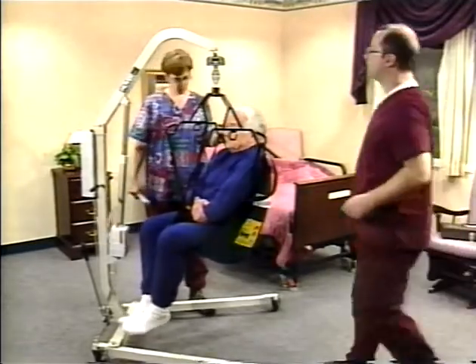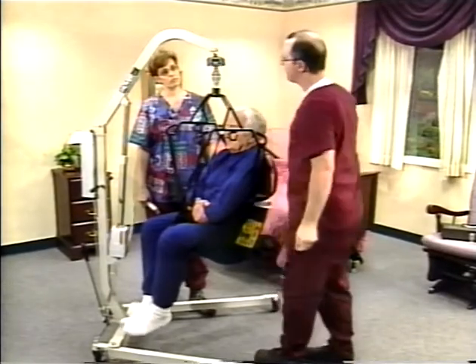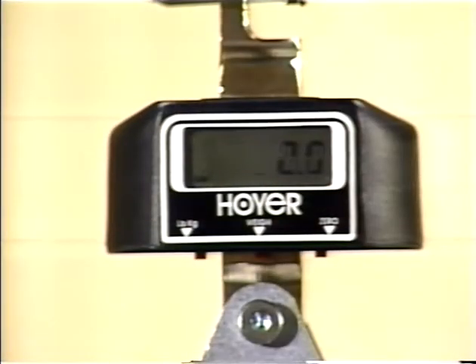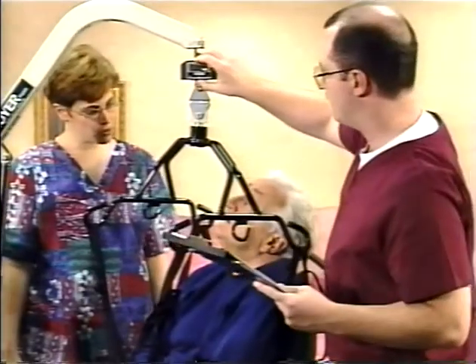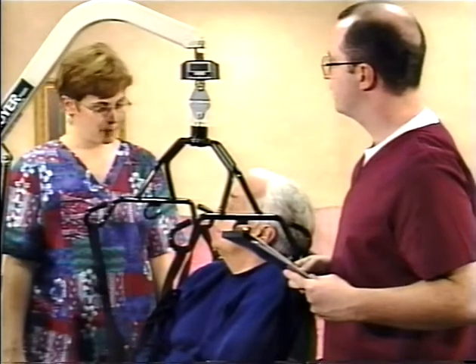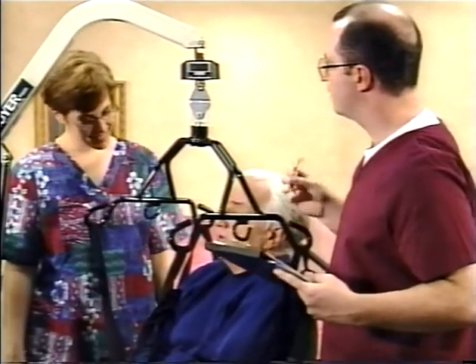Raise the resident until his feet are completely off the floor, but no higher, and read the scale. It's that simple. As you lift, the scale will give you a digital readout of your passenger's weight, accurate to plus or minus 1%. And there's no need to turn off the scale. The display will automatically turn off after 1 minute. If the display of your patient's weight goes off before you're able to record it, simply press the on button again. The original reading of your patient's weight will still be there.